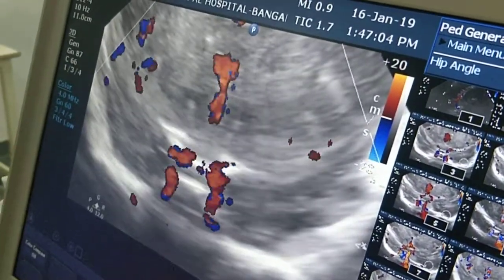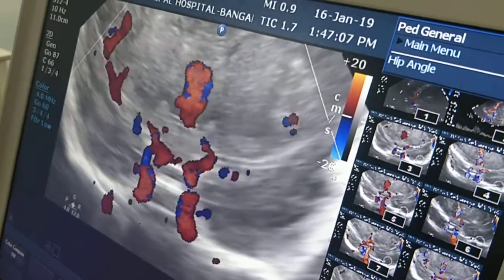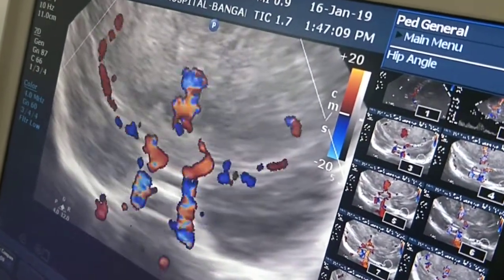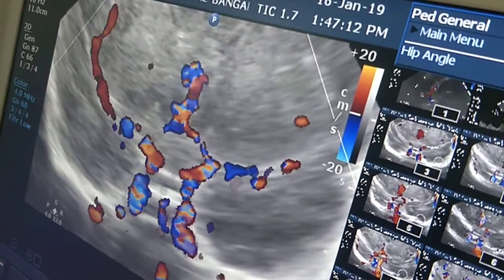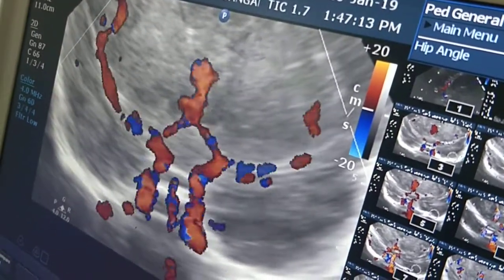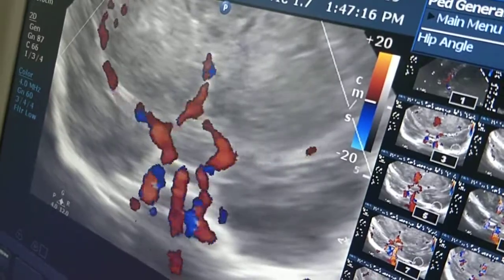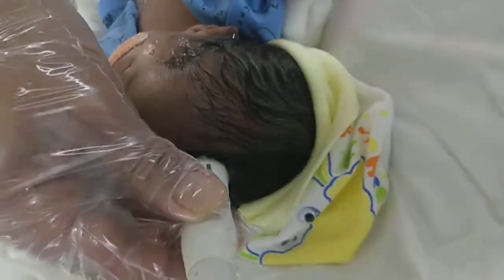So this is a beautiful demonstration of the circle of Willis on color Doppler, by placing the probe here in the coronal plane with the marker facing to the right.